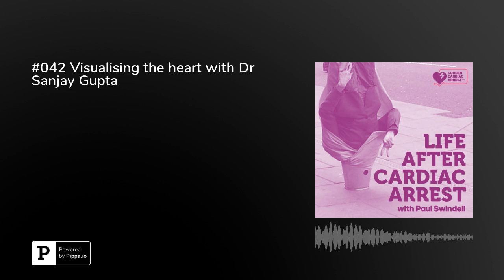But echocardiography has a problem. Not everyone has the best pictures. You have to get a window, and for some people who carry extra weight or who have ribs very close together, you may not necessarily get any kind of decent pictures to be able to make any kind of assessment of their hearts. MRI doesn't have those constraints. So with MRI, you're not so worried. You can still visualize the heart very well.